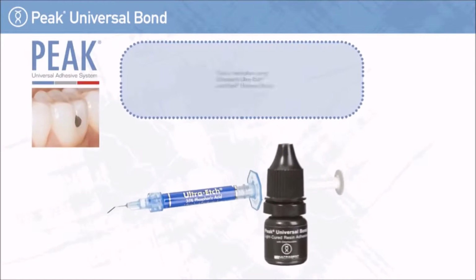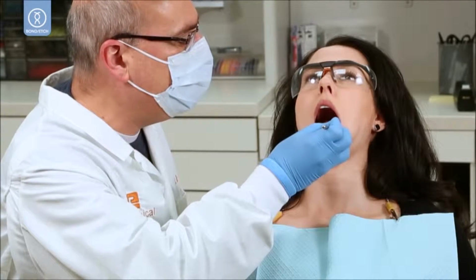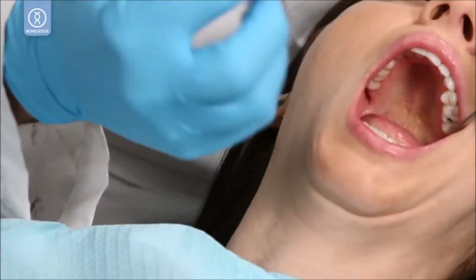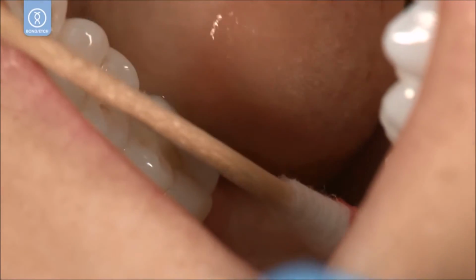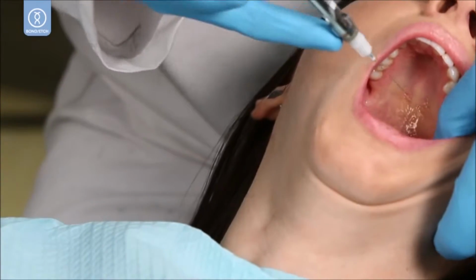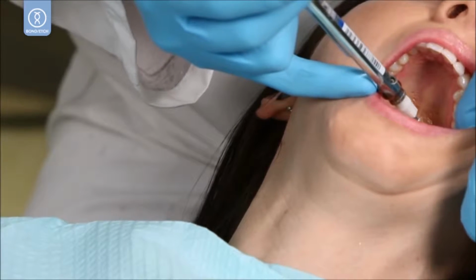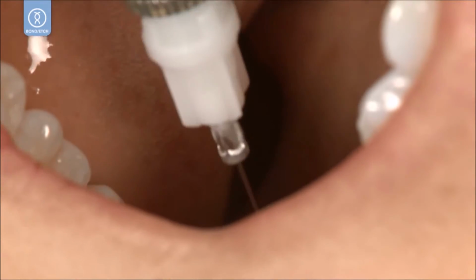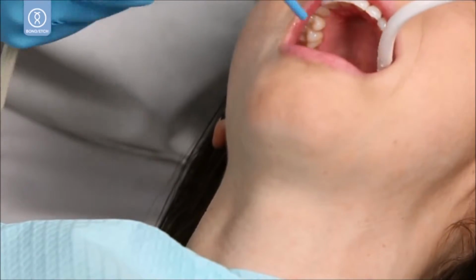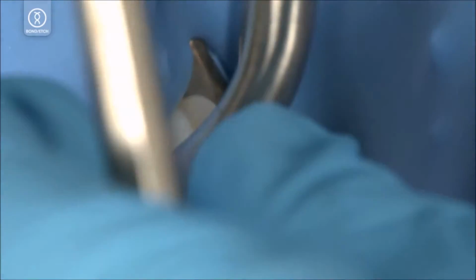Class 1 restoration using Ultradent's Ultra-Etch and Peak Universal Bond. Place Ultra Care Topical Anesthetic. Anesthetize. Rinse and vacuum. Isolate teeth using Dermadam and Dermaframe rubber dam frame.